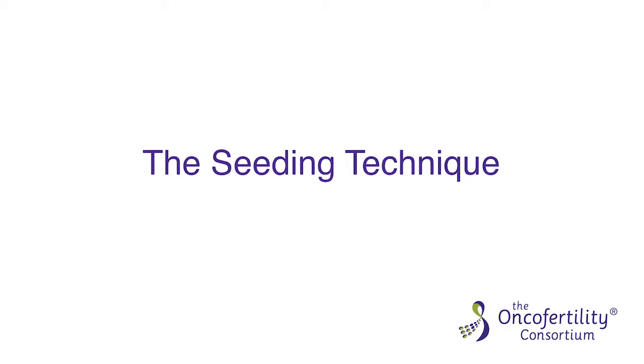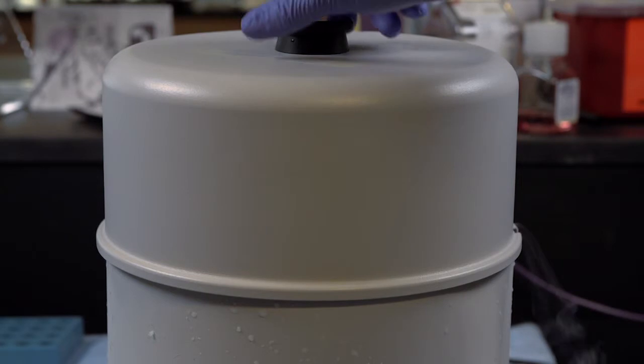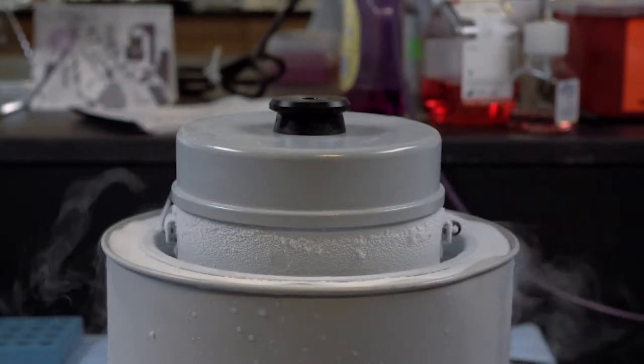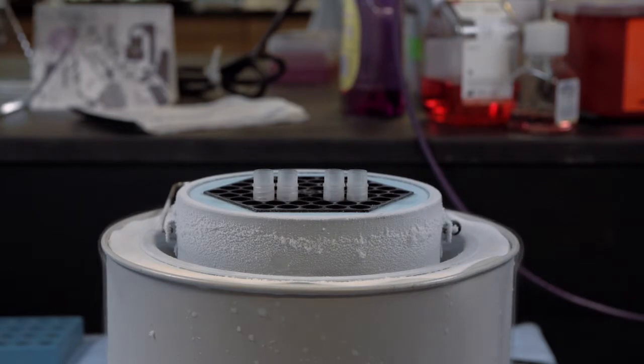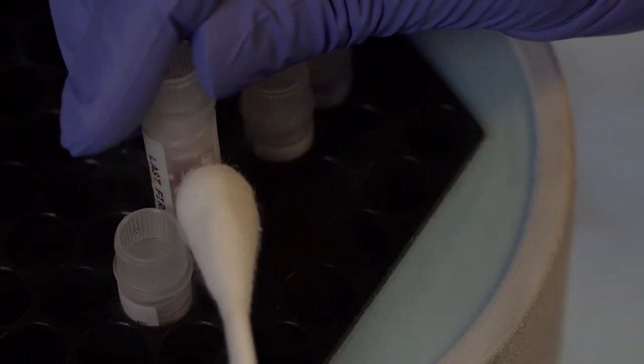The seeding technique is done manually and the easiest way to do this is to use a large cotton swab that has been immersed in liquid nitrogen. You can clearly see the seed this way and it can be done rapidly.